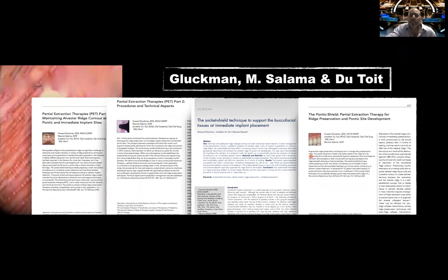And there's another concept coming out as well with the root membrane article. And there are more and more articles. Every month we're seeing more and more articles being published about this. So it's not a new concept, but there are a lot of different names. If we could just move past the name part and move into the actual benefit of the technique, which is a periodontal ligament mediated approach to retaining that buccal plate and soft tissue.